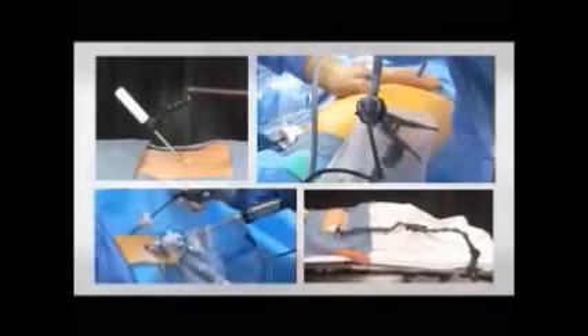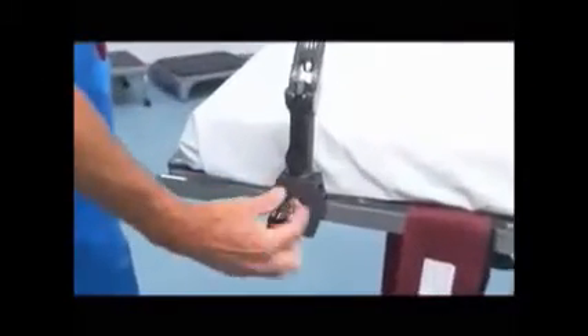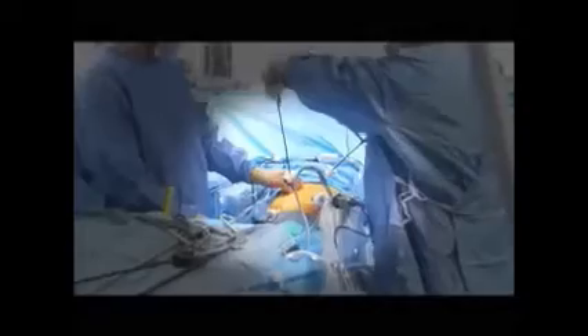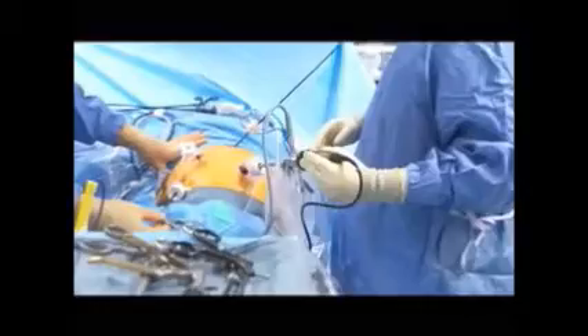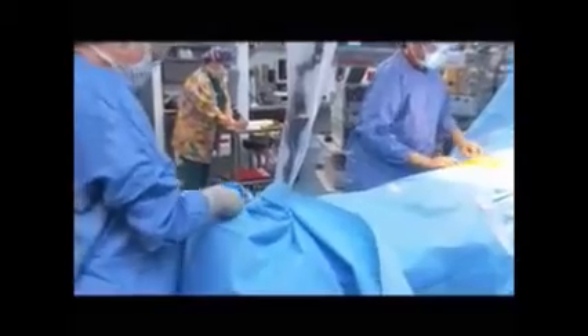The laparostat provides speed and convenience in any laparoscopic procedure. Start by positioning the rail clamp on the table rail so the positioning arm leaves the laparostat approaching the surgical field and is contoured closely to the patient. The device should be in the proper orientation to reach the camera port with minimal interference to adjacent ports and instruments, allowing a full range of movement for the laparoscope. The positioning arm and laparostat should be placed in an upright orientation for draping and moved into operating position when the surgical field is prepared.